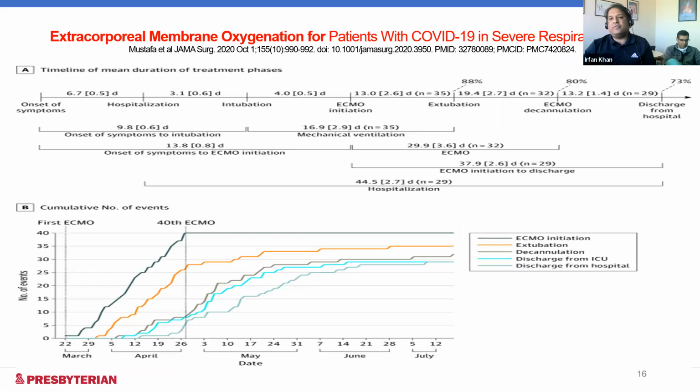Then a study comes along, that's from October 2020. Basically, this happened in Chicago. There's a center that started doing these dual lumen cannulas that are placed in the right IJ, basically an RV to PA cannula, essentially protecting the right ventricle, seeing if the outcomes are better. For some reason, the outcomes ended up being extremely high survival. So these patients were hospitalized and then intubated, and then within 4 days of intubation, they were placed on ECMO. They remained on ECMO for less than 2 weeks before they were extubated, and then subsequently decannulated within a month. And then they were discharged home 2 weeks following that. So as you can see in these graphs, the survival was huge.